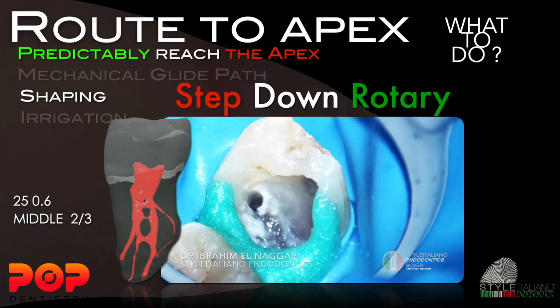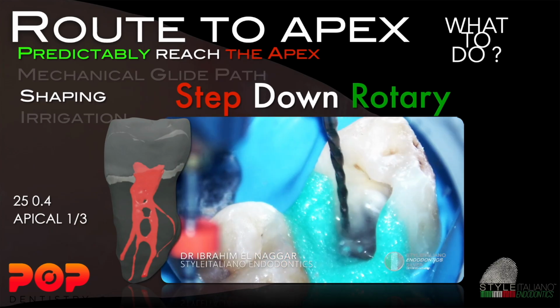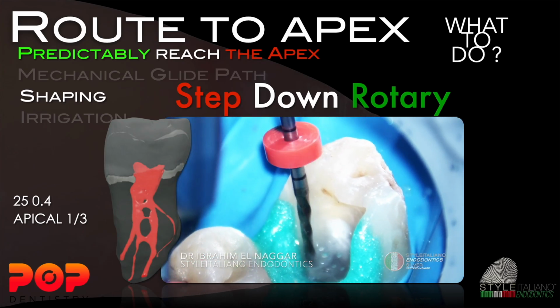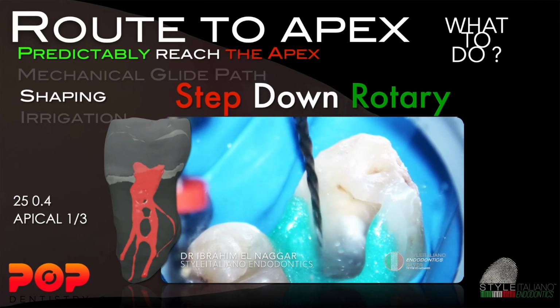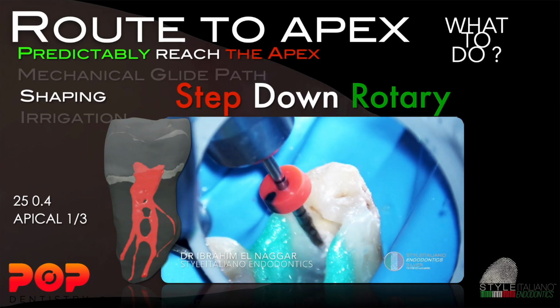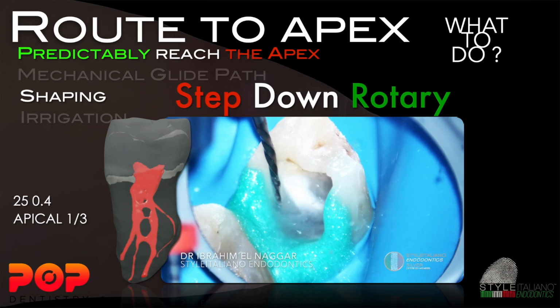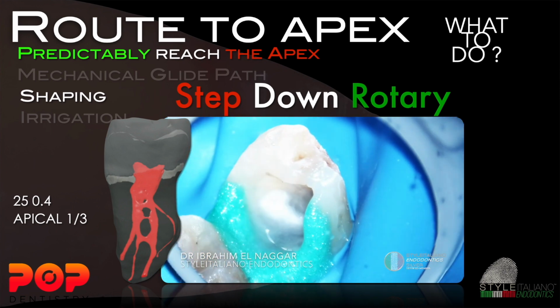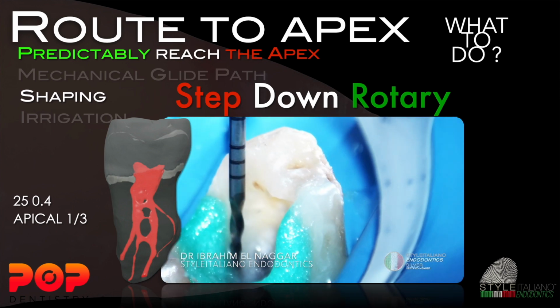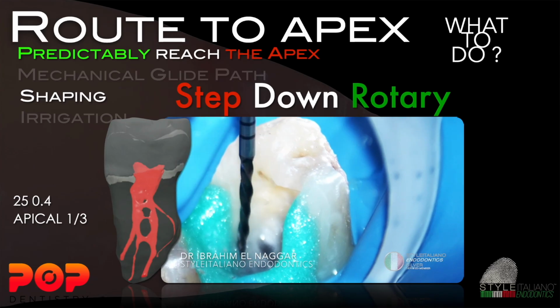After that, I was able to finish the case with the 25.04 to be much more conservative, not to bring the 25.06 till the apex in a tight canal. You can see the file reached the apex, so simple, and we are flooding the chamber with irrigant solution. Why? To make the file clean every time the file gets out, and every time the file goes inside the canal.